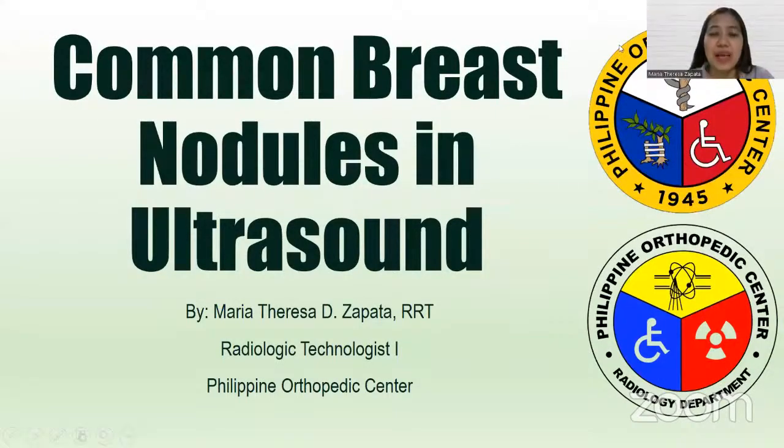Good evening, everyone. I am Maria Teresa Zapata from Philippine Orthopedic Center, Radiology Department. Our topic for tonight is about the common breast nodules in ultrasound.